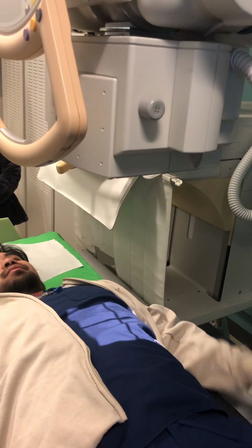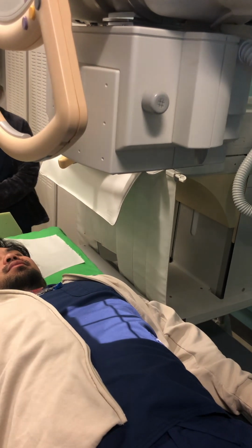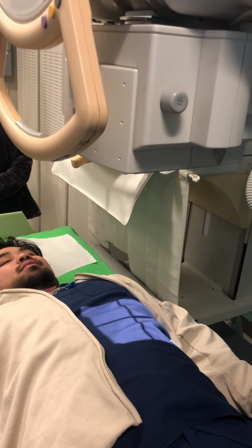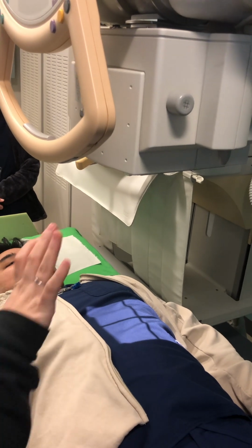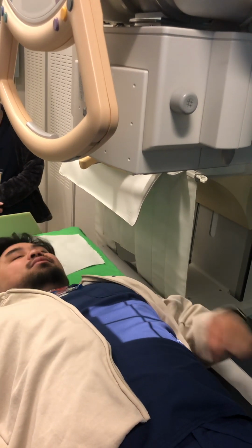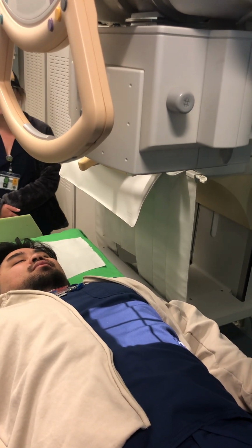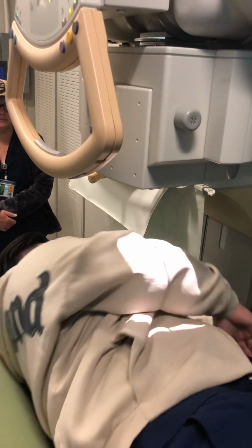All right, so this would be the AP for the left side. Again, these are the lower posterior ribs, so they are not the ones that curve all the way around the side. So just our shorties. And again, take a deep breath in, blow it all the way out. Good, okay? And then, now you get to roll to your left as well.